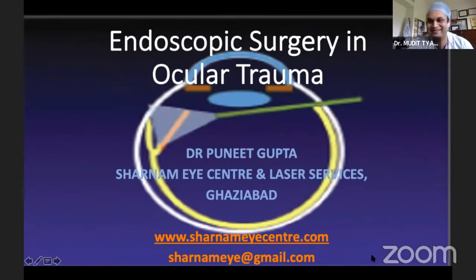Yeah, I'm there. No, the same thing. The initial learning curve can be, like what Vinod said, a bit of a challenge initially. But once you do get the hang of it, once you start trying to localize the structures and move your instruments in plane along with your orientation, then I think it becomes easy. You can overcome most of these problems.